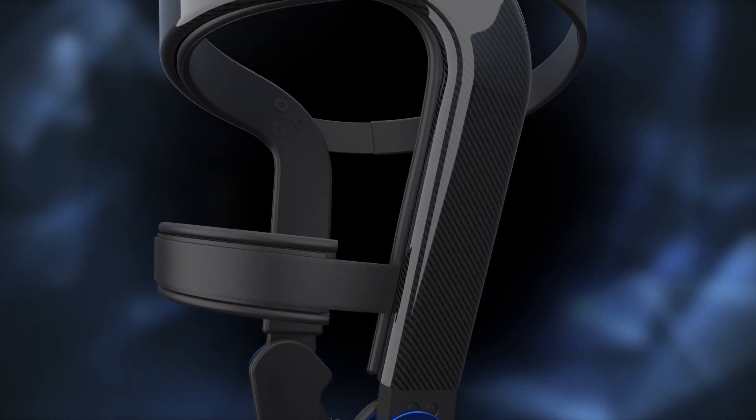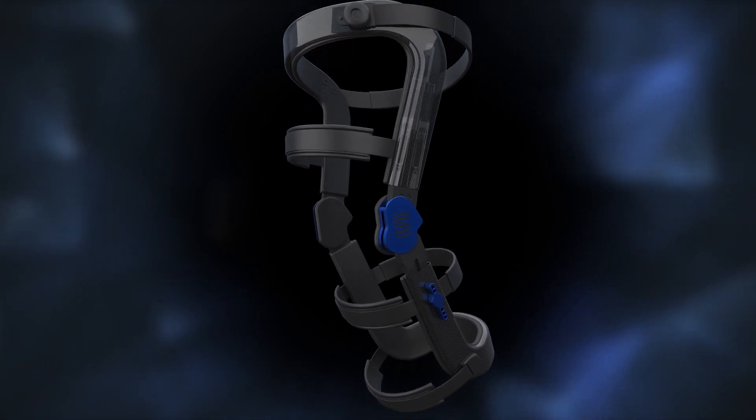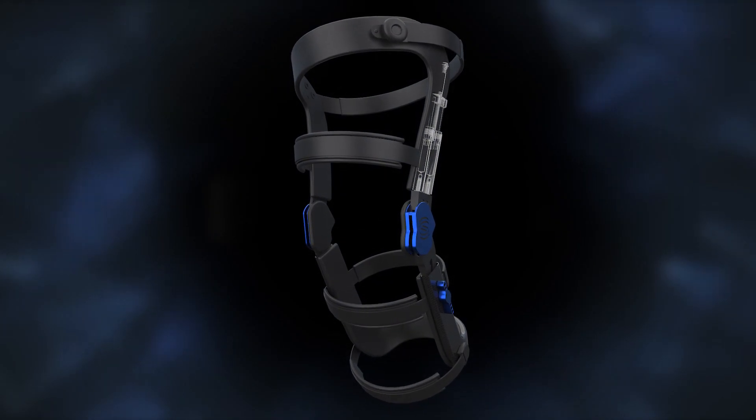Spring Loaded Technology has developed the next generation in knee bracing for osteoarthritis and injury with our Tri-Compartment Offloader Technology. Equipped with patented liquid springs, our Tri-Compartment Offloader is the only brace capable of reducing forces throughout the whole knee.